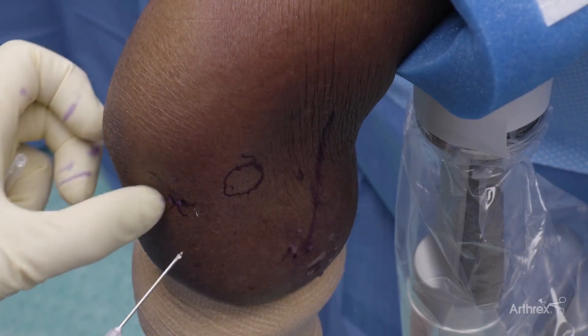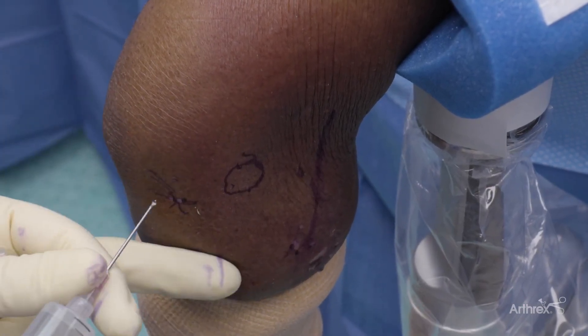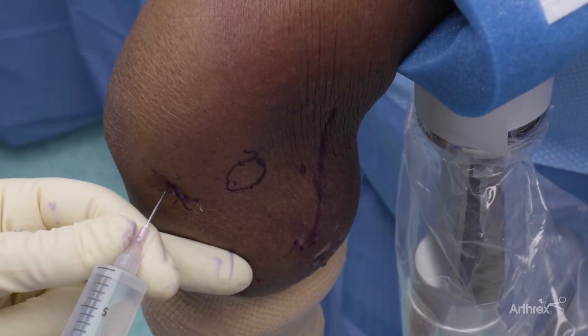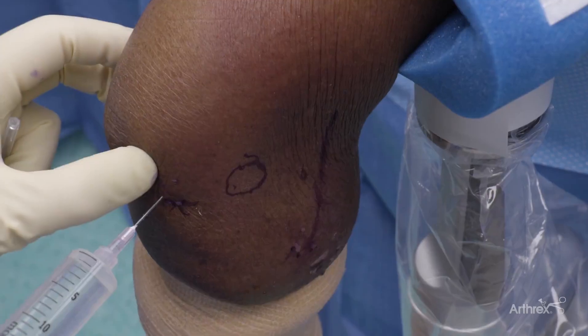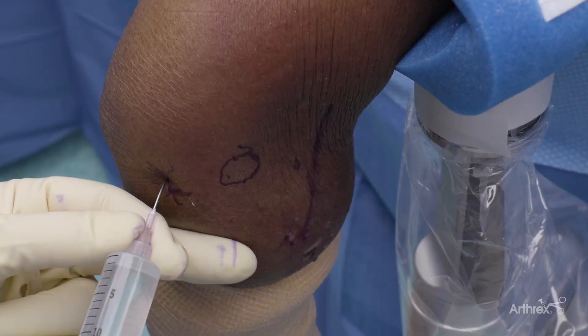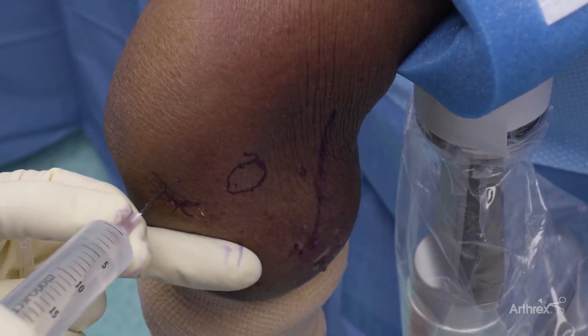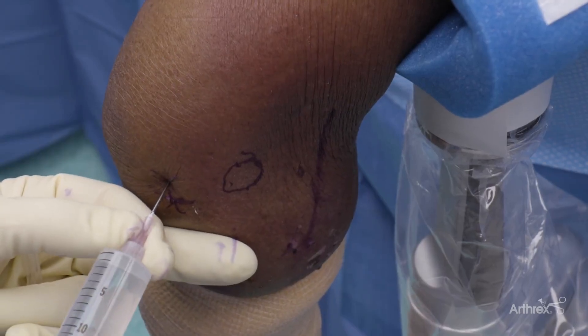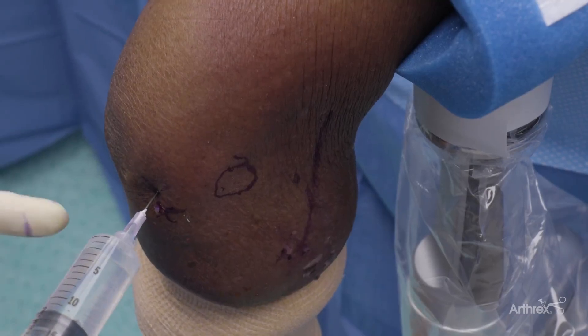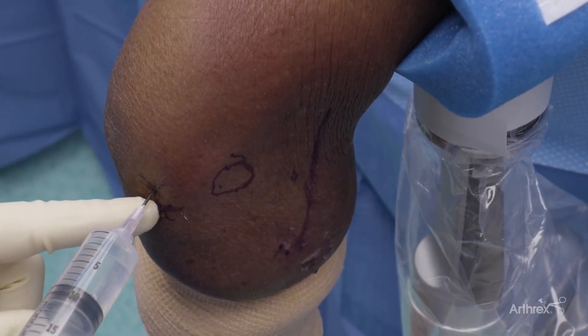What I like to do is through the radiocapitellar or posterior region, just inject some fluid. This does two things. It allows me to make sure I'm in the right plane while I'm doing the procedure, and you can feel and make sure that you're happy with your position. If not, you can move it. One is you can see the fluid come back, and also sometimes the hand will rotate as the joint distends.